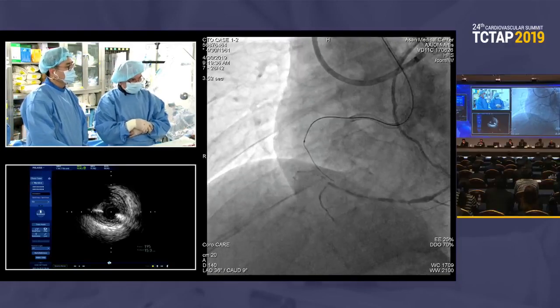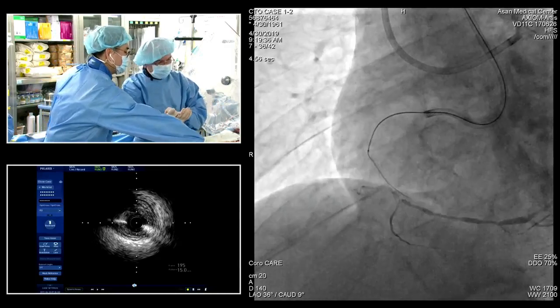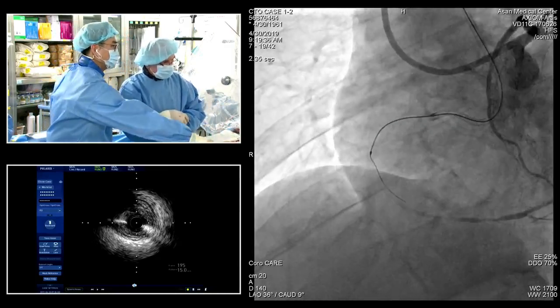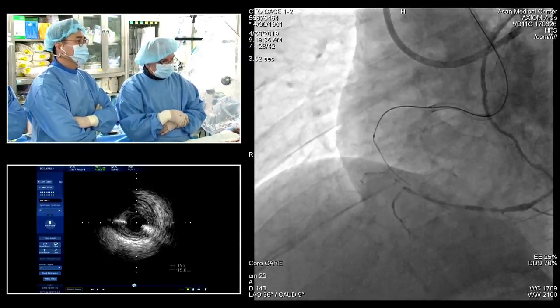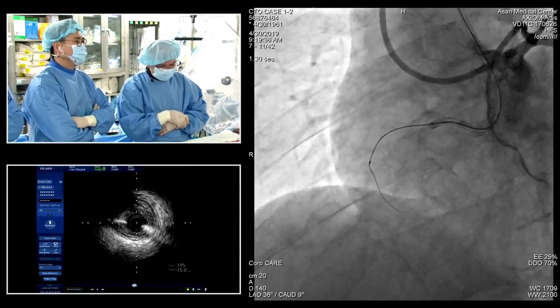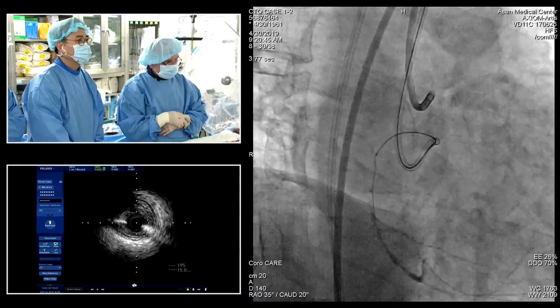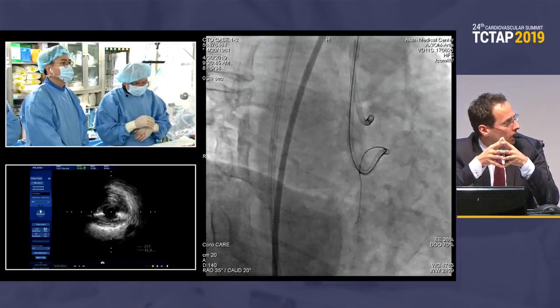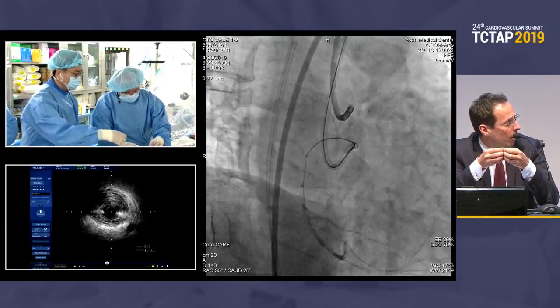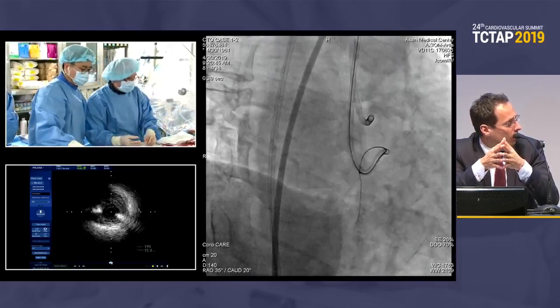And I don't know about Dr. Asakura. Has he turned right completely to ADR now, or do we still do parallel wiring in Japan? I prefer to do parallel wire technique. Okay. So that's where we are here right now. We have removed the Fine Cross. May I ask one question, Dr. Asakura? I mean, now we have the IVUS finding. So when you do parallel now, would you go with a dual lumen microcatheter into the proximal cap because the puncture was somehow correct? Or would you go with a second microcatheter completely parallel? So would you use dual lumen or not?